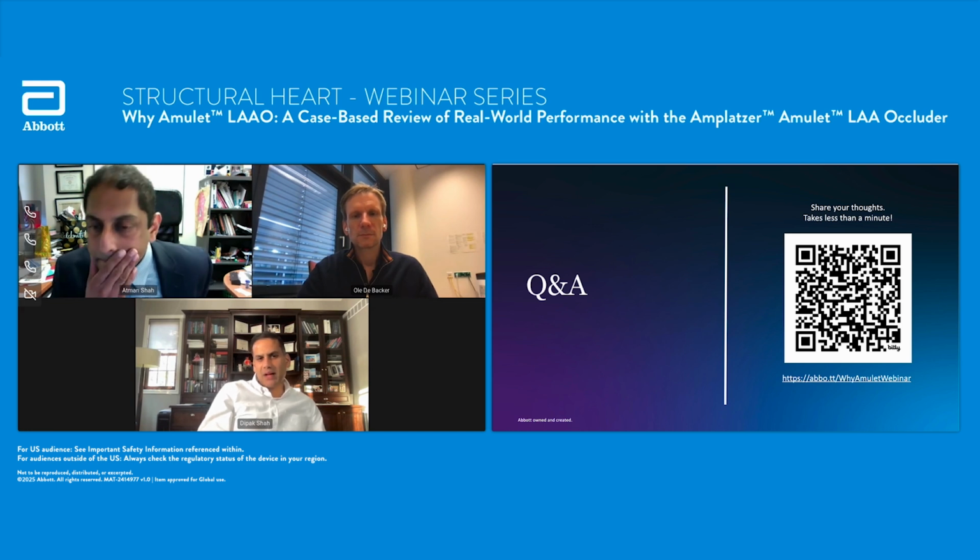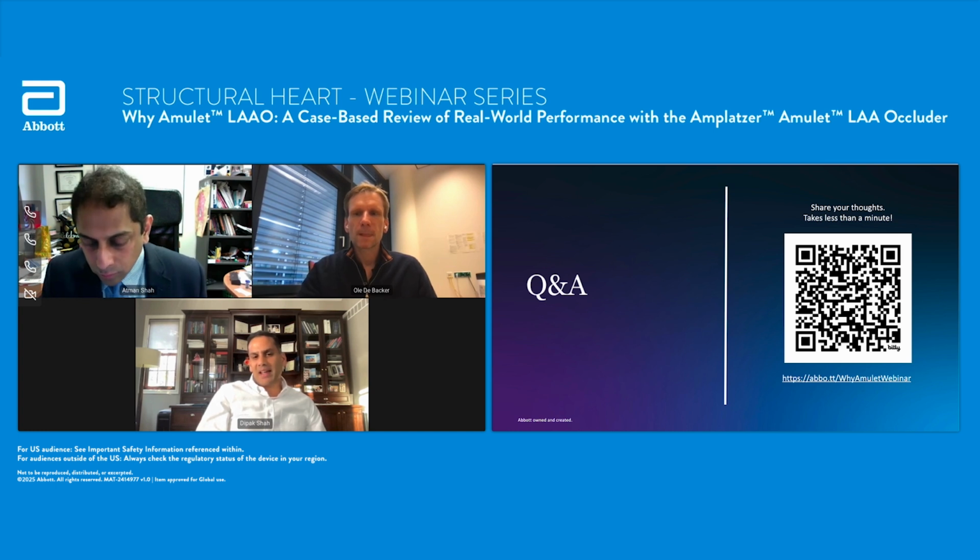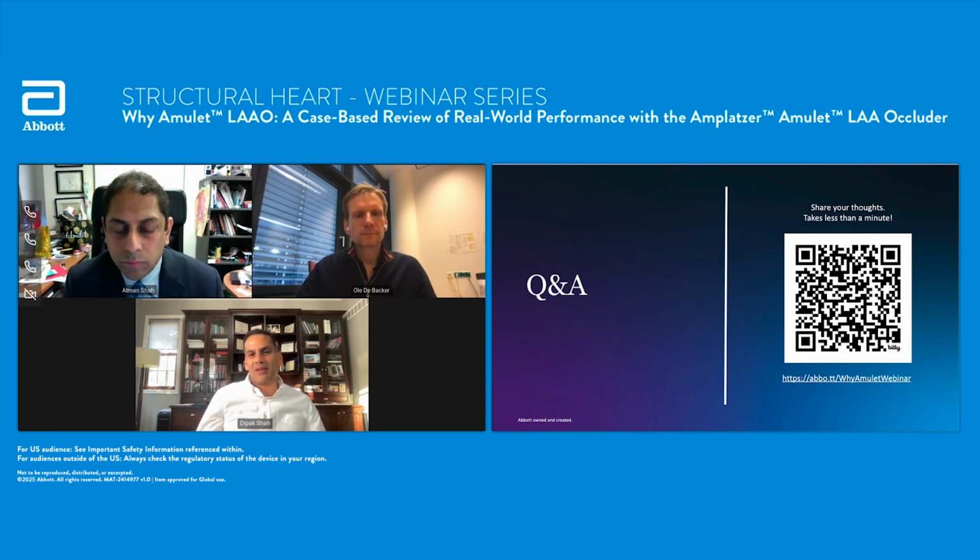Yeah, I think based on the LAAs data, the data suggests that we use anticoagulation in all these patients. And obviously, a lot of these patients who've had surgery are high risk. So you're kind of stuck, because looking at the guidelines, the US guidelines become quite confusing. So on a lot of these patients who can't be on anticoagulation, we'll get a CAT scan. And as you both have said, the CAT scan really doesn't lie. And if there's any sort of remnant, then to more safely treat the patient, you either keep them on anticoagulation, or you're going to close it with an Amulet device. And that's been our approach.